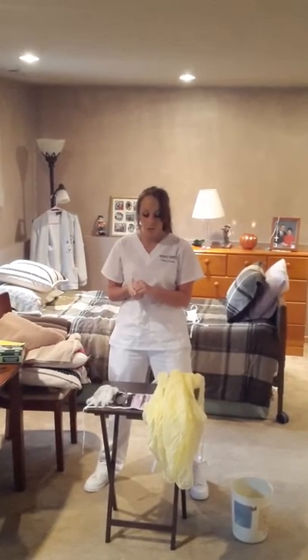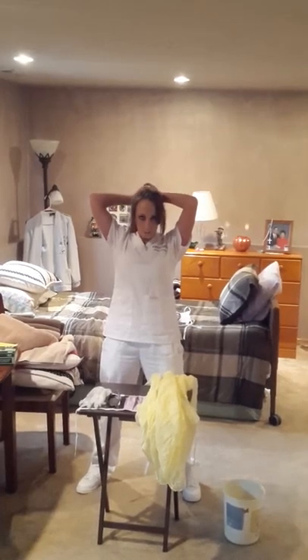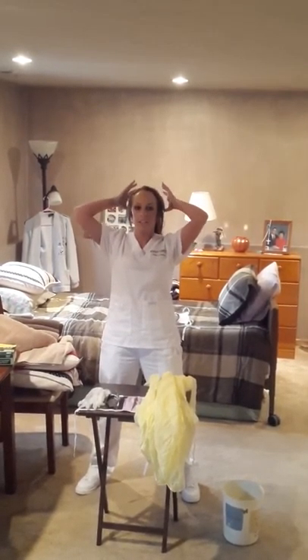First, I'm going to put on a cap, which I do not have, so I'm going to pretend. You want to make sure your hair is pulled up and completely out of your face in the cap.